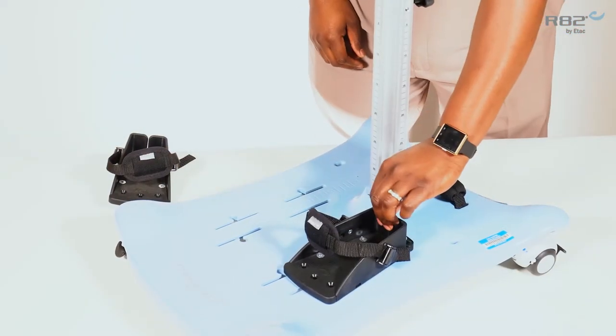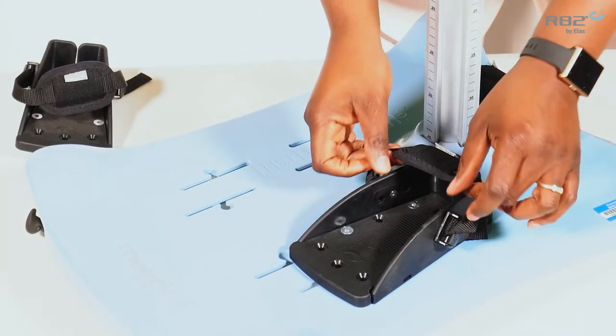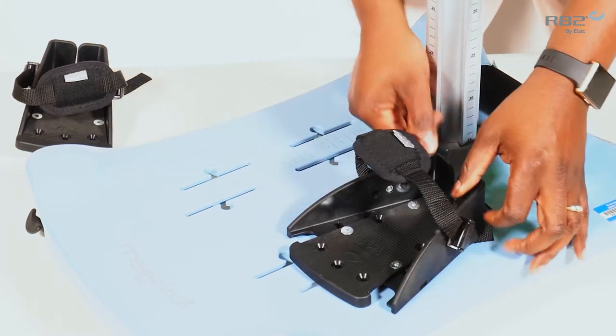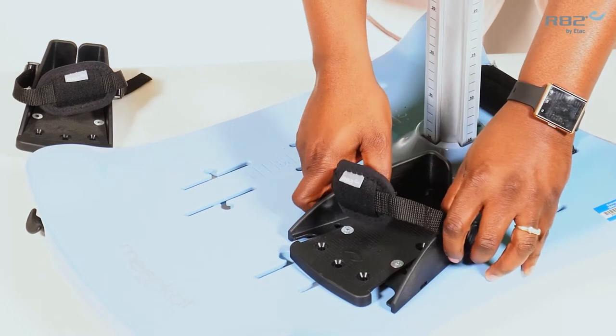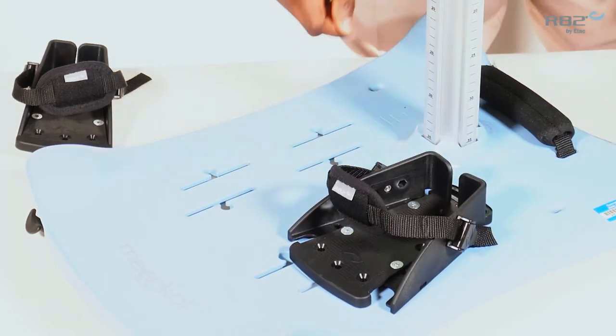This will secure the sandal into the track. Each sandal has the ability for width adjustment at the forefoot and at the heel. Once you reach your desired width, tighten the 4 bolts on the sandal.